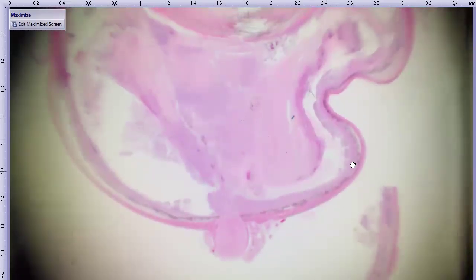The inflammatory reaction mainly affects the posterior segment of the eye, which suggests either a contaminated penetrating trauma coming from the sclera or something systemic spreading to the eye through the choroid and retina. So we will focus on the back of the eye right away for time's sake.